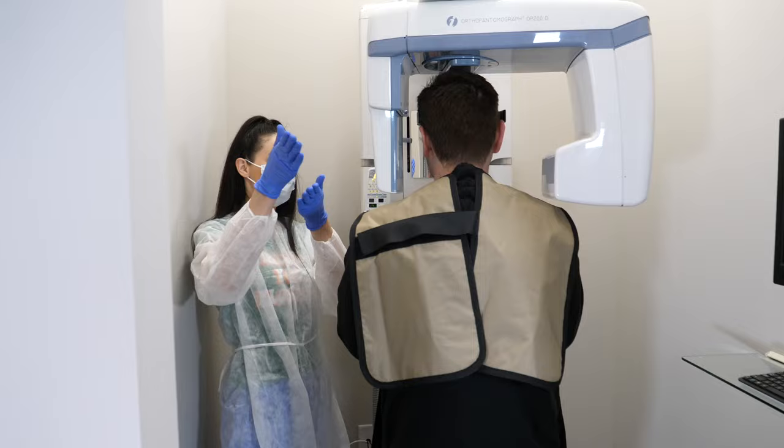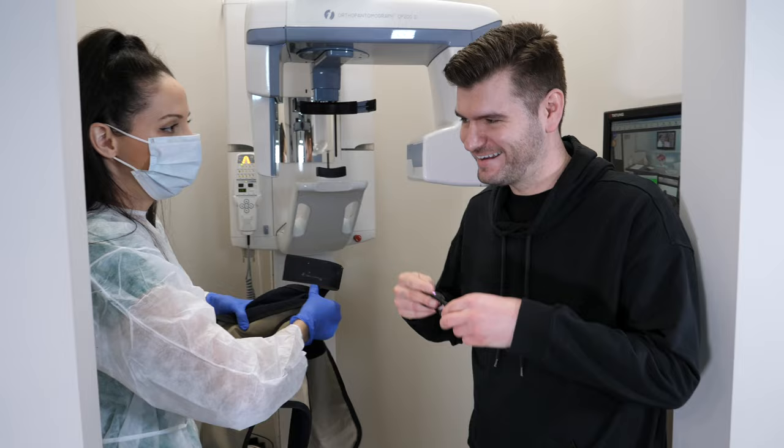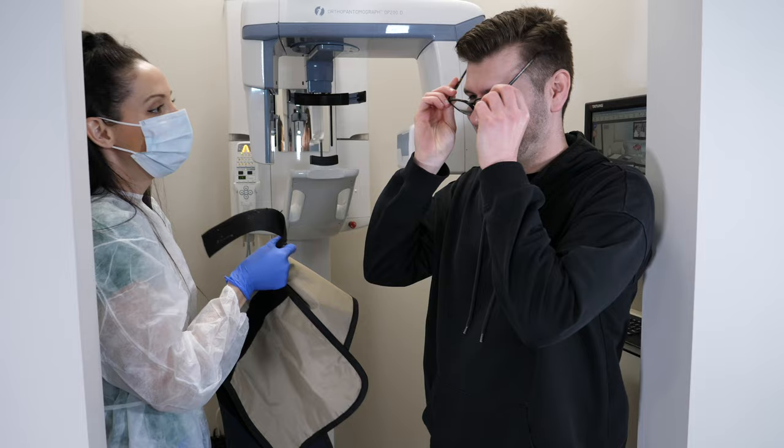They will take off the lead apron and check to make sure that your image came out clear. If it looks good, then you can put your metal stuff back on, such as your glasses, and you are all set.